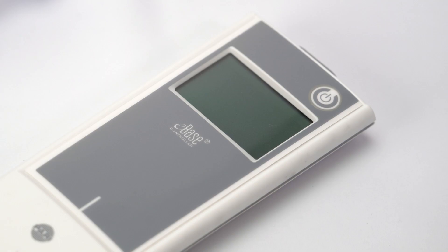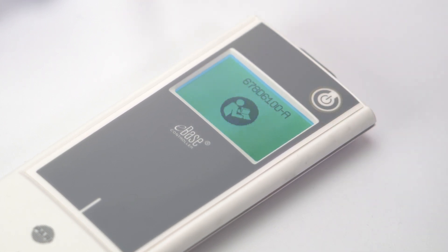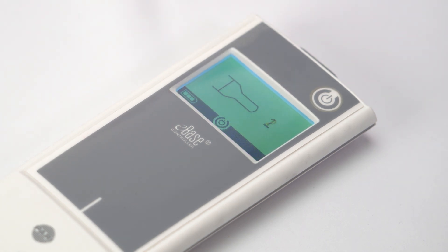Switch on the device by pressing the controller on-off button. You'll hear one beep and the eFlow technology logo appears on the display. The device is now operating. You'll see a timer running down from 3 to 1 before treatment starts. After that, the controller will display the treatment screen and aerosol will begin to flow into the aerosol chamber of the nebulizer handset.